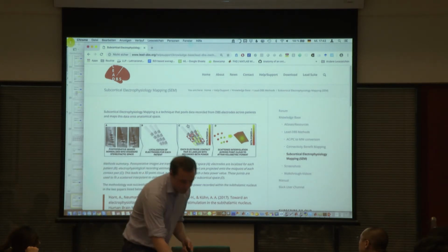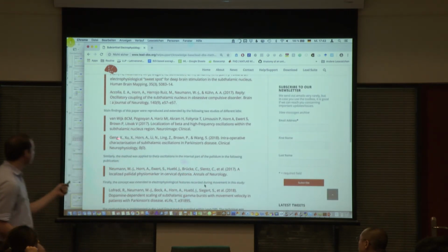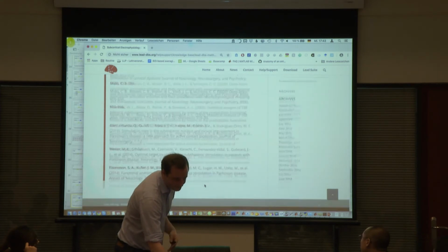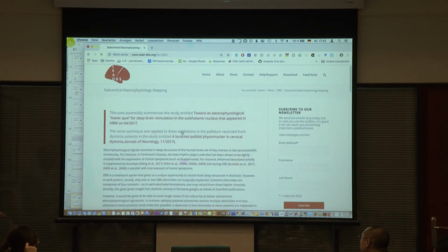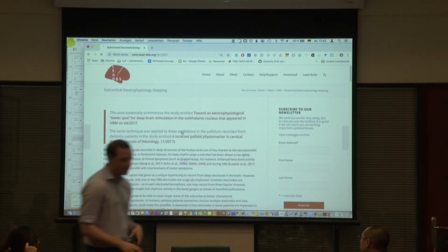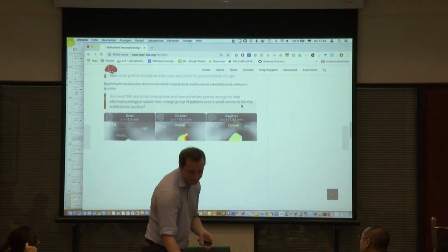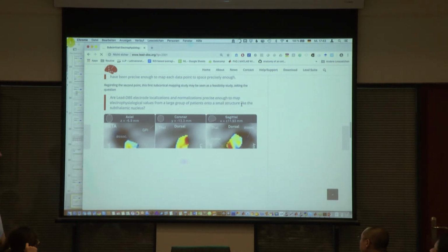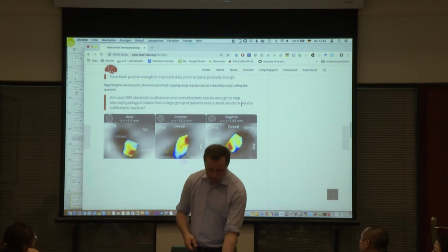And we have quite some papers now that use this. Also, Shinji Gang basically used it and presented it yesterday as well. I think there's a blog post that goes through the paper a bit, and it's very easy to understand. So it basically has this, and then we have these targets, and then we map the beta power here and so on. So this is something to bear in mind if you're interested in these types of analyses.